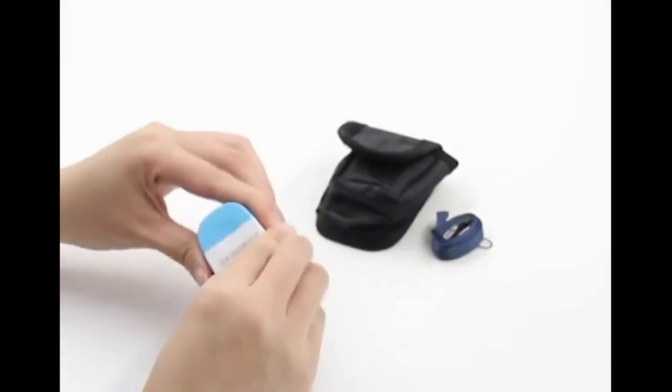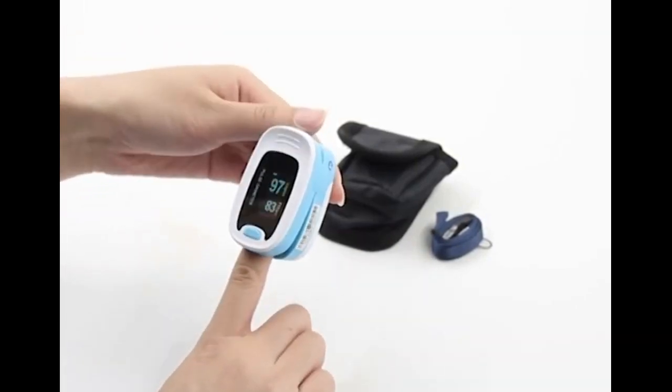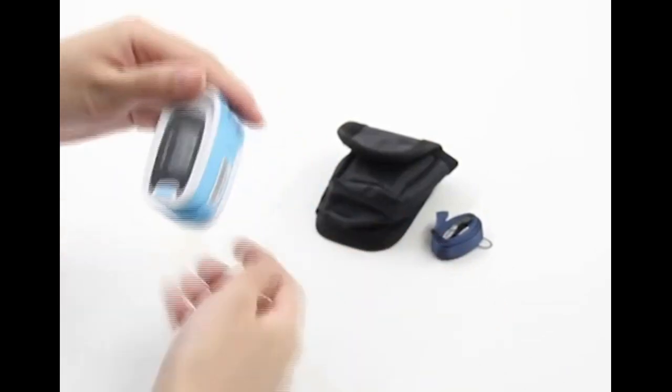What's included? The Context Pulse Oximeter, 1 handy carry pouch, 1.5V AAA alkaline batteries (x2), 1 long lanyard neck/wrist cord, and 1 user manual.